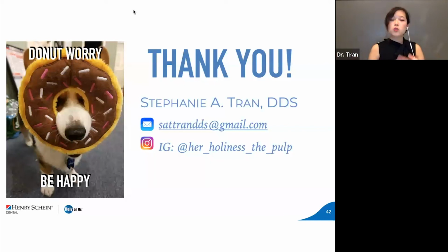If you place too large of a post, doesn't matter whether it's fiber or metal, you're going to put the tooth at risk. Additionally, if the metal post is really twisted and tightened into the tooth and there's excessive force, then that's going to put it at risk as well. So in general, the rule of thumb would be to avoid posts as much as possible. With bonding dentistry, we very rarely have to put posts in as much as we used to. And if you absolutely have to use a post, a fiber post or some sort of bonded post is going to be better.